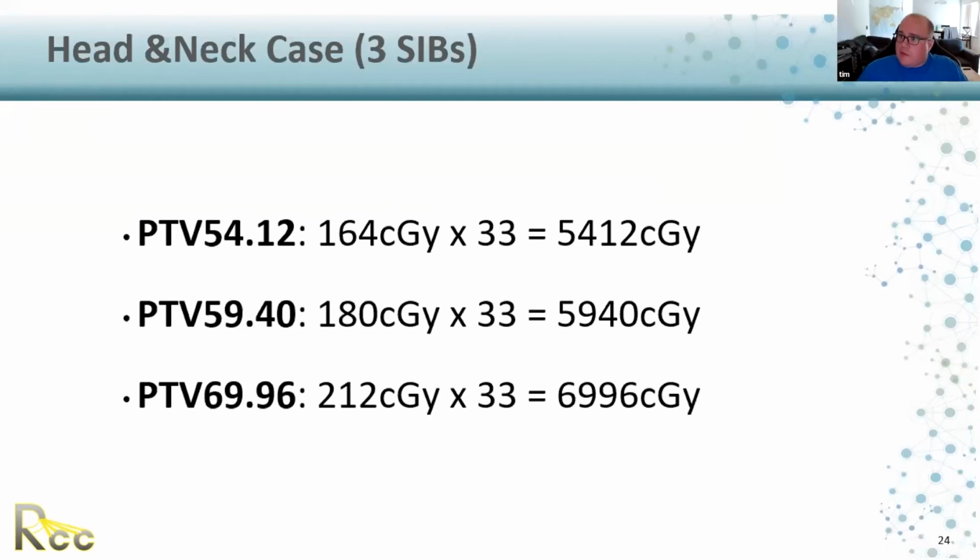Awesome, thank you. We have two questions about SRS. One, can you just talk about dose rate with SRS? Is 600 dose rate okay, or what might be the problems with that?